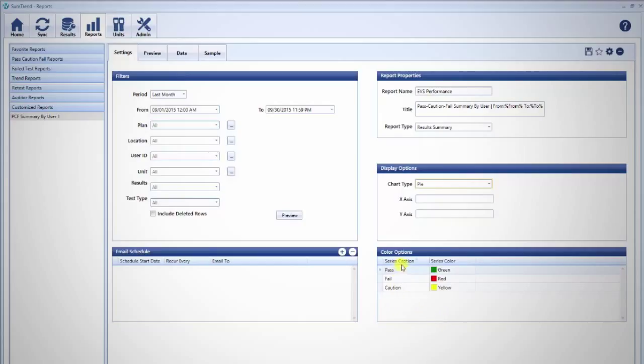Chart colors can also be customized. We recommend green for pass, red for fail, and yellow for caution.